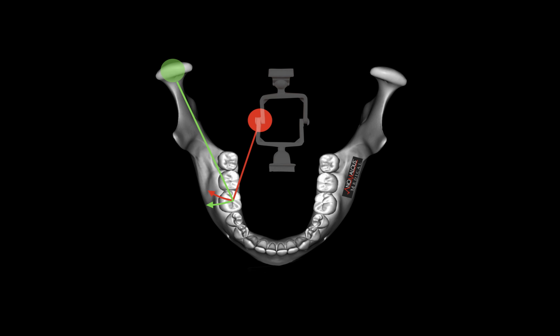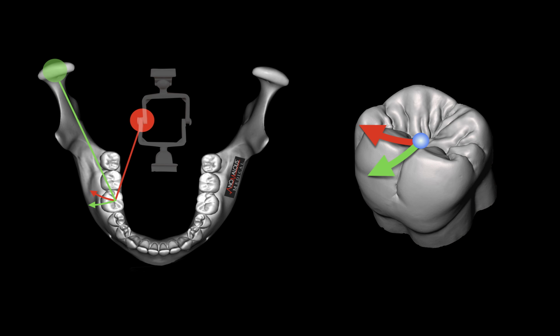And again, it depends on how this clacker is mounted relative to the models, whether you're using a quadrant or full arch. But take a look at the rotational pathway drawn from the tangent. So if you pick the wrong instrument, you can actually create a positive error that necessitates a lot of adjustment at chair side. And this is not fun.